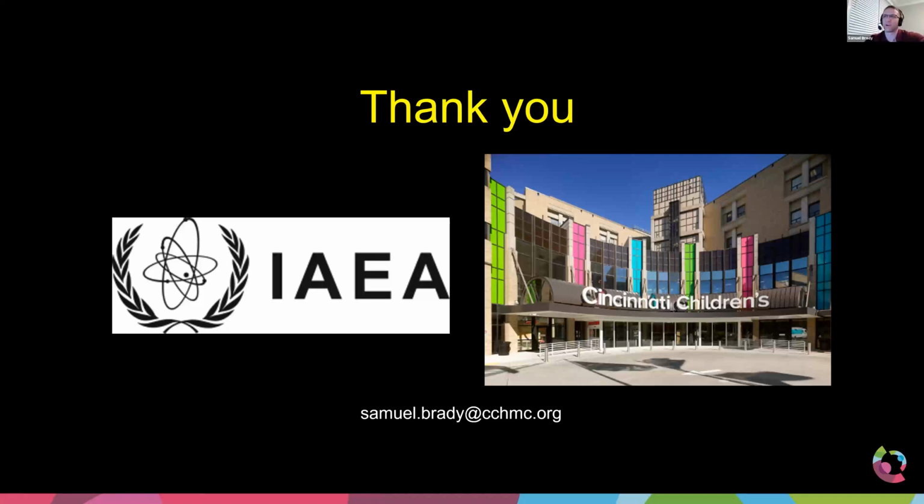I would say neuro probably was a little bit quicker to adopt CBCT, and that's obviously because it's easier to do a spin of the head. You can just position it at the end of the table, and the system can quite literally go right around it real quick, and it creates a nicer looking image because of the way they can acquire it. But now that it's getting more popular in the chest and of course the abdomen and pelvis, there's a lot of room for continued growth and development.